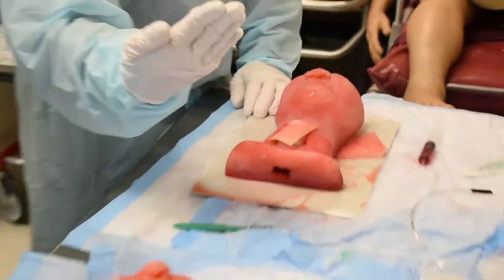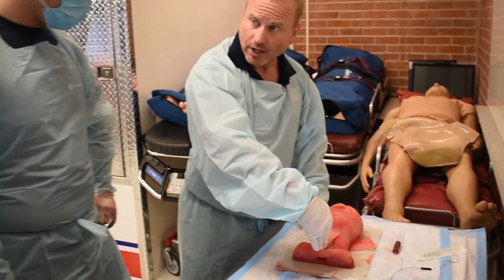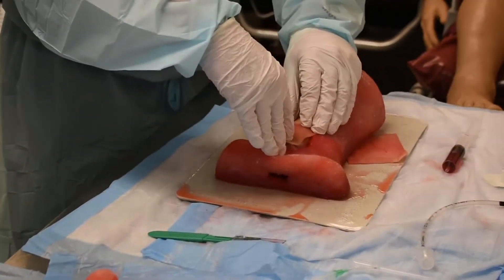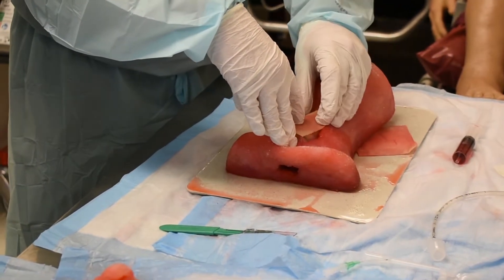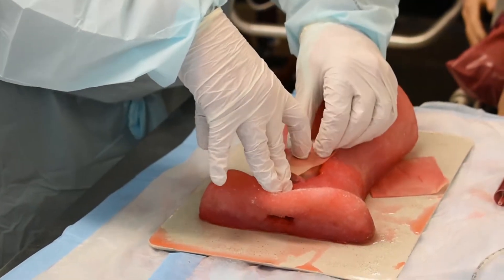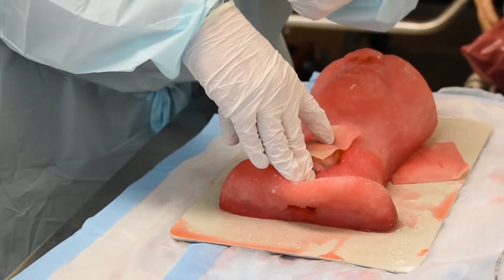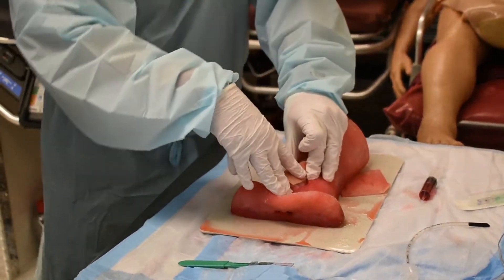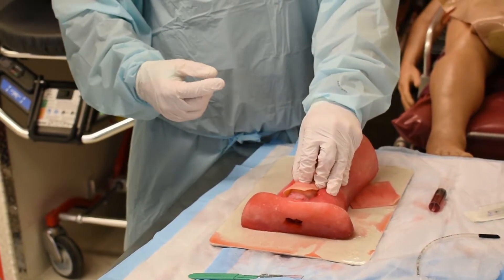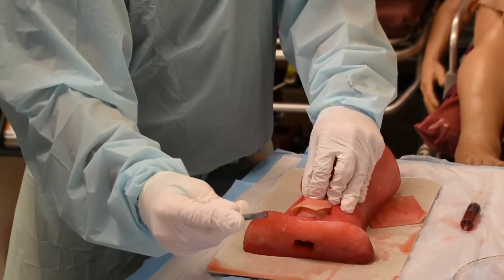So here's how you're going to do it. You're going to make your cut just like I taught you before. Knife hand — pinky on the patient's sternal notch. Take your index finger and walk it up to the cricothyroid membrane, which is always below the big Adam's apple, the thyroid. Once you find it, take your left hand — thumb and middle finger — and tent that skin as tight as you can. Now your finger marks where your cricothyroid membrane is. Unshield your scalpel.